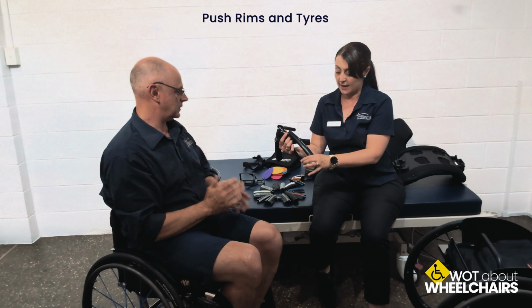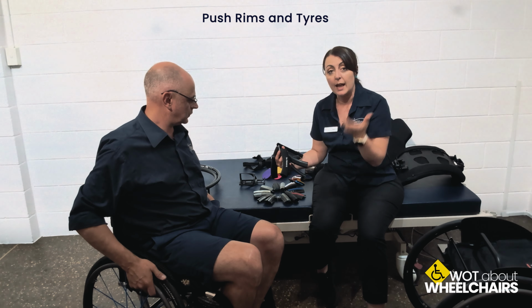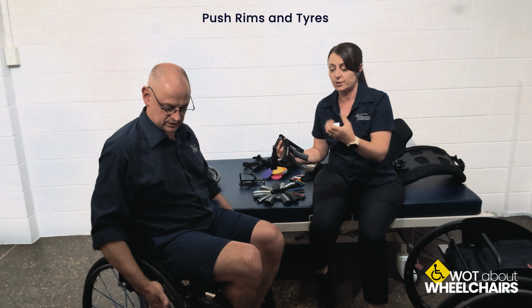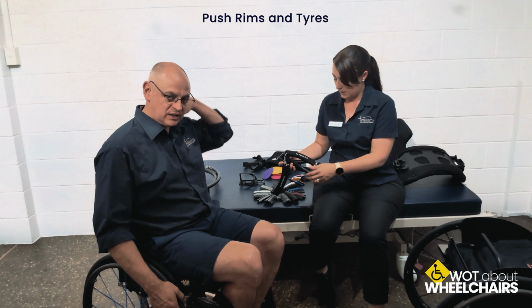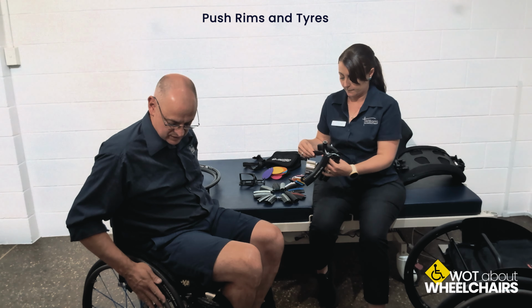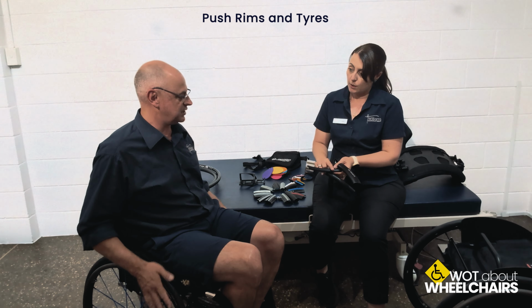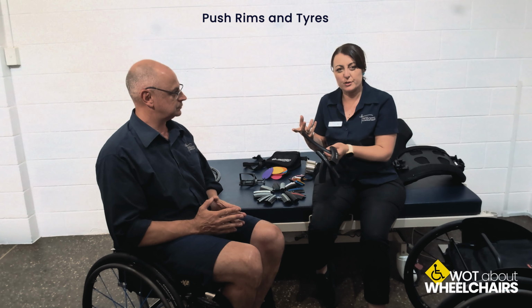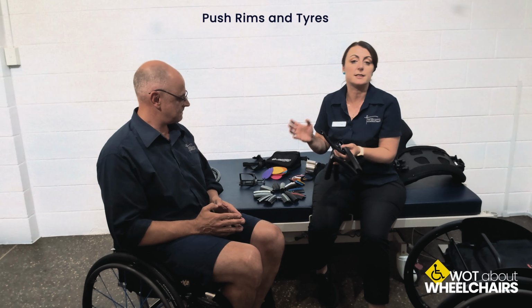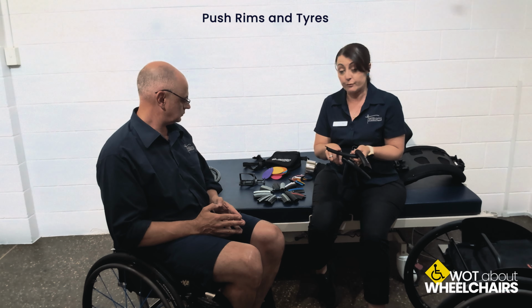I might think about that for a larger guy who's got larger hands and wants to grip easily, or has got less grip capacity. So they're more of a pusher with an open hand, maybe a C level injury where hands are starting to be affected. Rather than a small tube, you might want a bigger, thicker tube. You can also get a double kind of coating on it, which helps with grip again. So it's really personal choice. It's your personal preference. If you know that your hands have been slipping on your current wheelchair push rims, then we might look at a different choice.